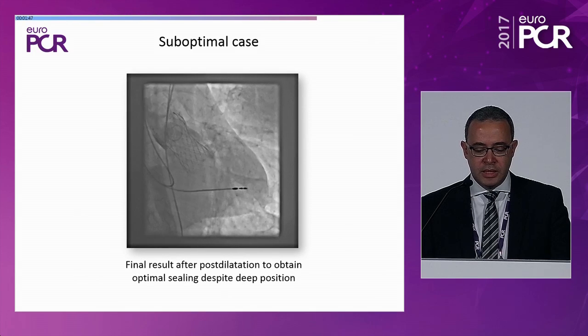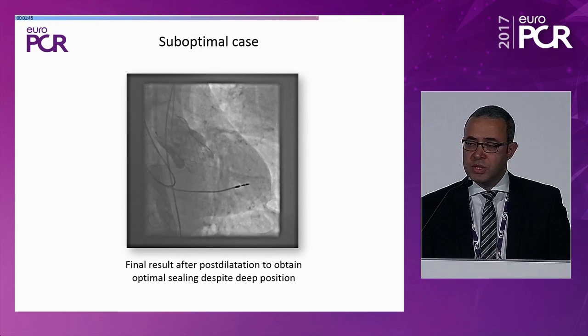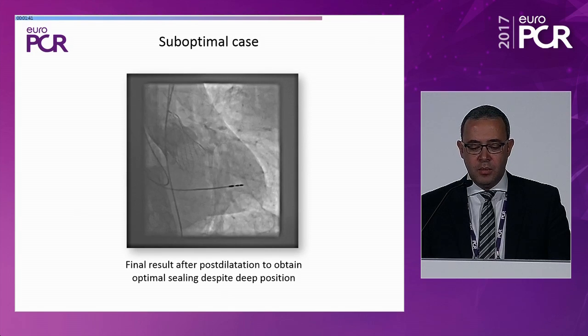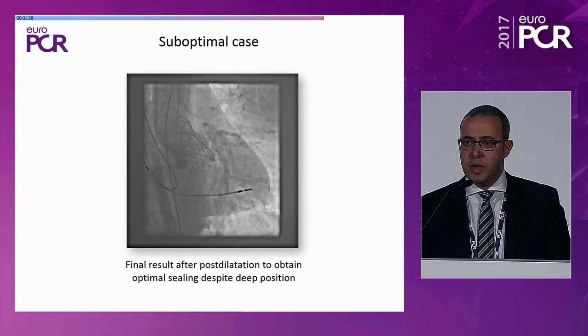In this particular case, even after doing these maneuvers, the valve was implanted deep. Fortunately, after post-dilatation, it was sealing, but this is not the optimal scenario and you can do it better.